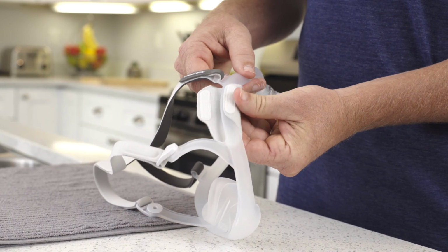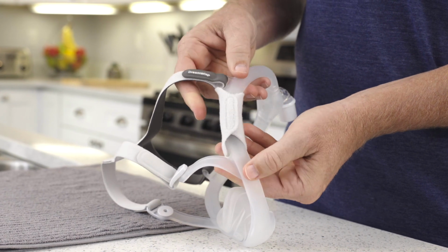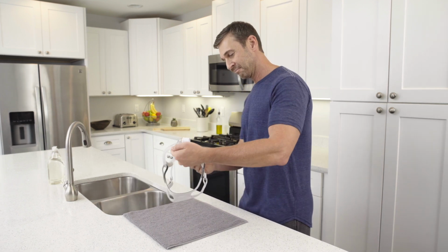Wrap the optional fabric sleeves around the mask frame so that the seams are on the outside, away from your face. Your DreamWisp mask is now correctly assembled and ready for use.